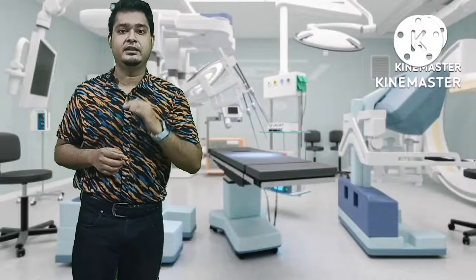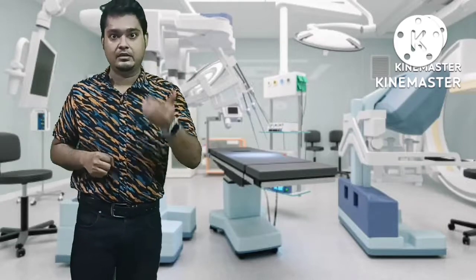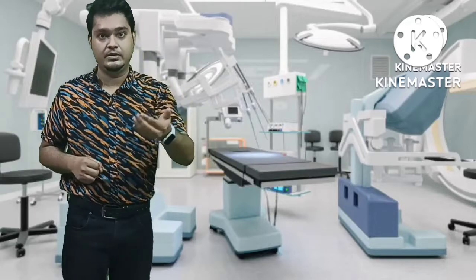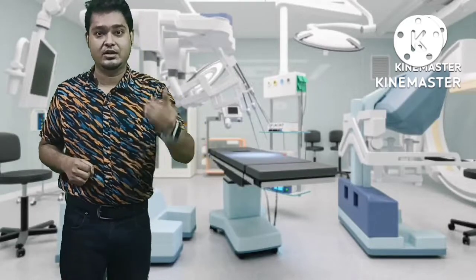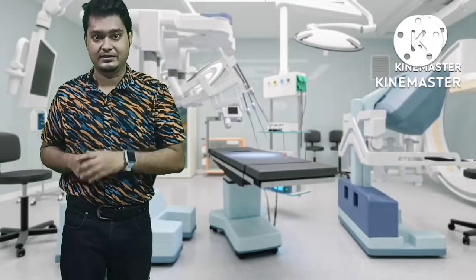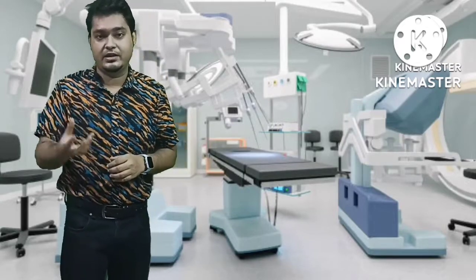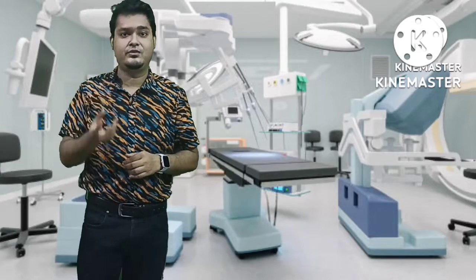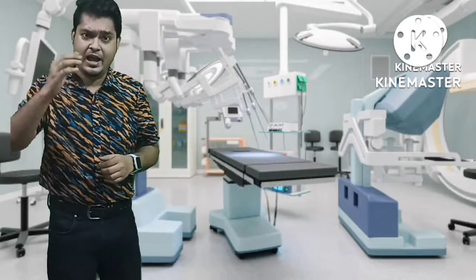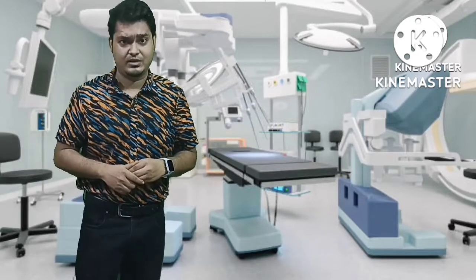Okay, the second thing is that to perform the angiography, particularly coronary angiography, in traditional catheter angiography the amount of contrast media used is very less. But in CT coronary angiography, the amount of contrast media we administer into the patient's body for performing the examination is higher as compared to catheter angiography.